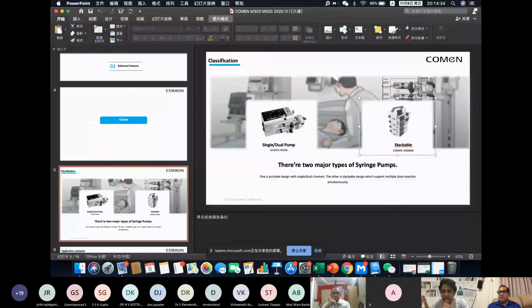Kishore, sir? Yes. Can I ask a question, please? Yes, please. Thanks for this beautiful presentation. How much is the battery life if you have to take a child or move a child from A to B position? Does it hold a battery? Can we use it for transport system as well?